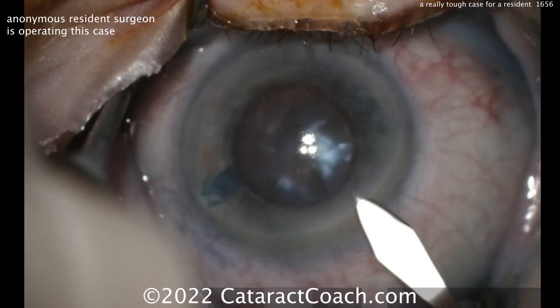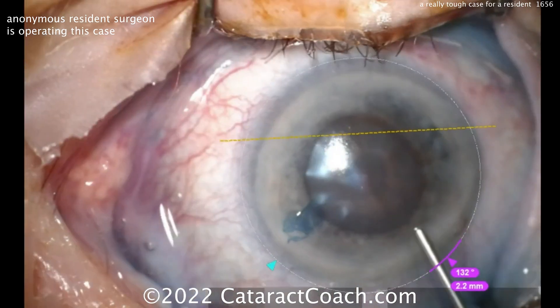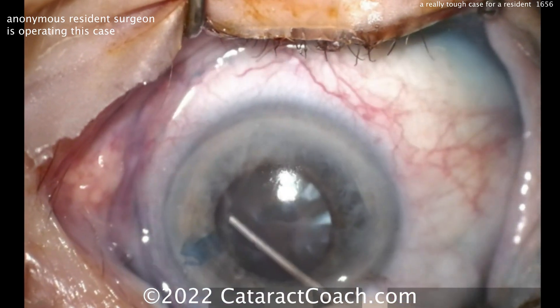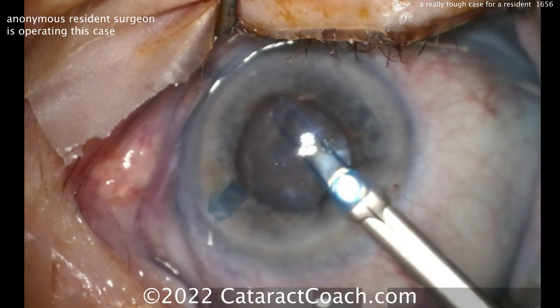Look at that 2.2-millimeter keratome — it's pretty big compared to that dilation. That's probably a 4, at best 4.5-millimeter dilation. So a little bit of viscoelastic going in here. You're probably going to want to put in some iris hooks, or there we go — a pupil expansion device, a Malyugin ring.